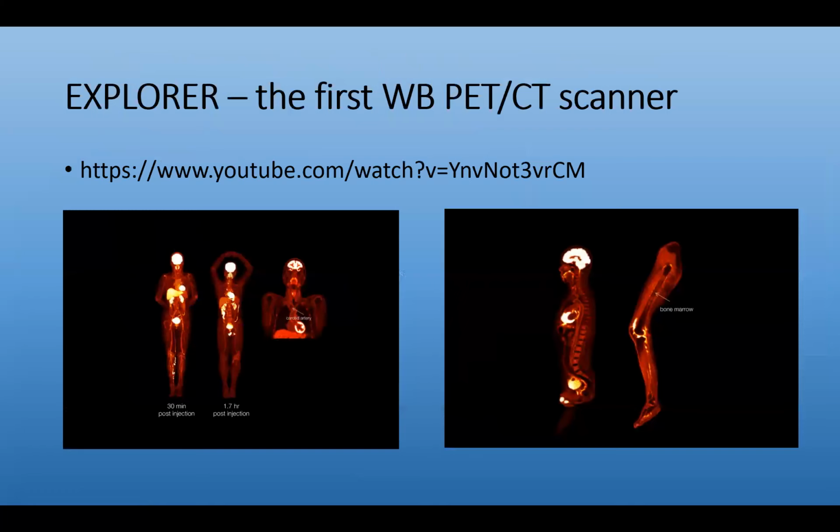One of the newest innovations, though, has been the introduction of the first whole body PET CT scanner. You can go on this link here and see a video of it, but it's pretty cool, right? You get a whole body PET in just one bed movement. And of course it can do SPECT. Well, not SPECT, I guess it's PET, but can do the cine, which is pretty cool. If you go on to this website, you can see this. So as I say, this was revealed at the SNMMI in June.